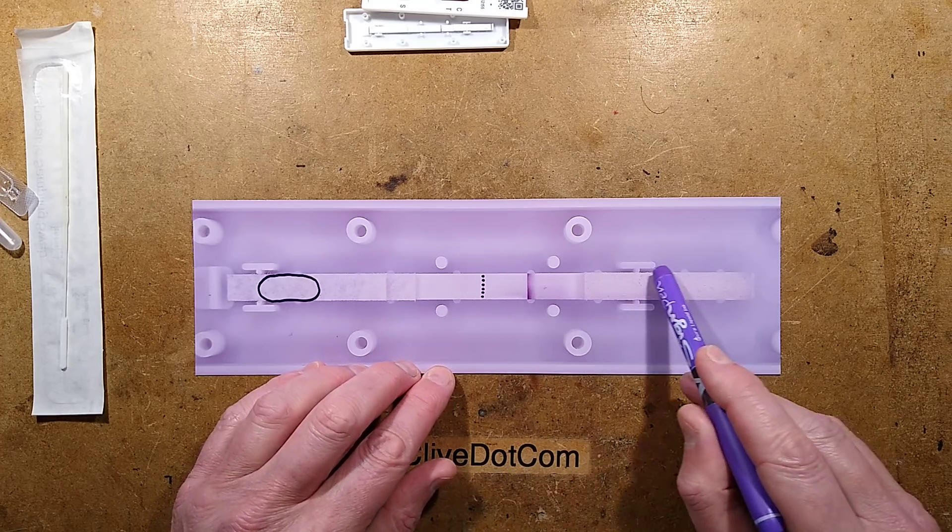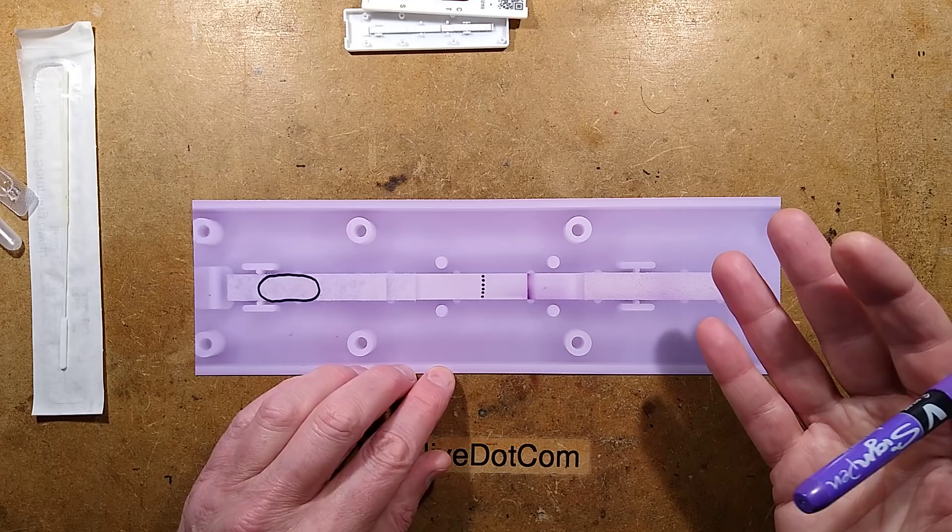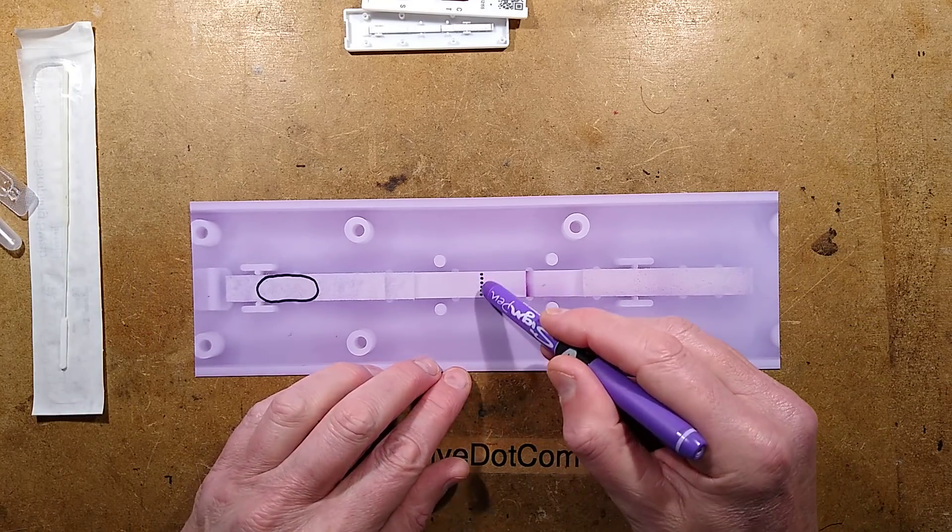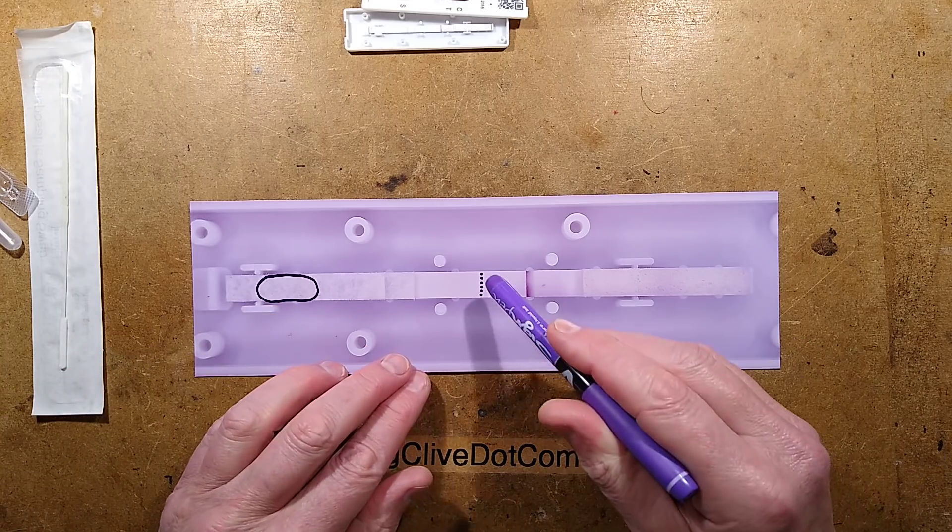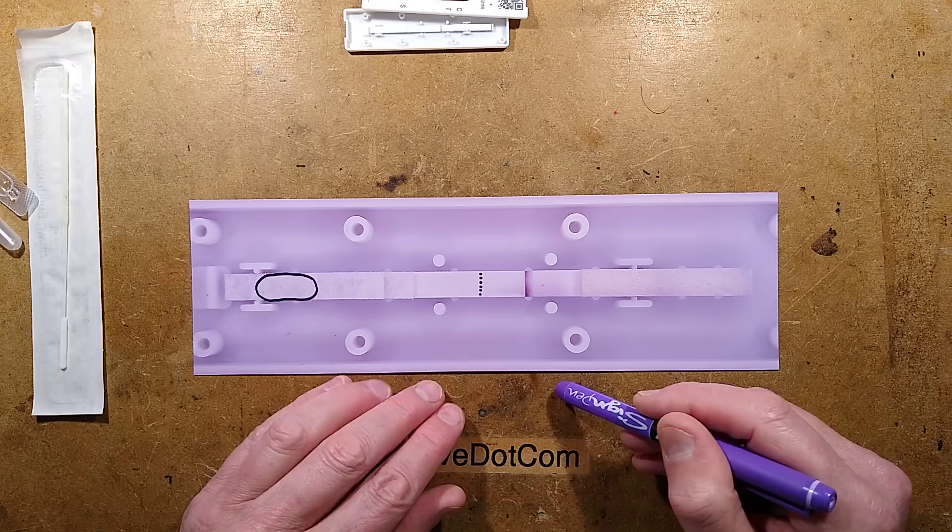The liquid then continues into this pad and that is just basically the waste pad where it just collects all the residue. And that's fundamentally it - just the fact that these antibodies, these little keys that latch onto that signature will make the line visible. That is fundamentally how the test works.